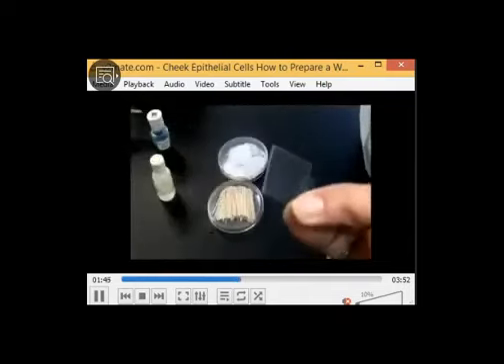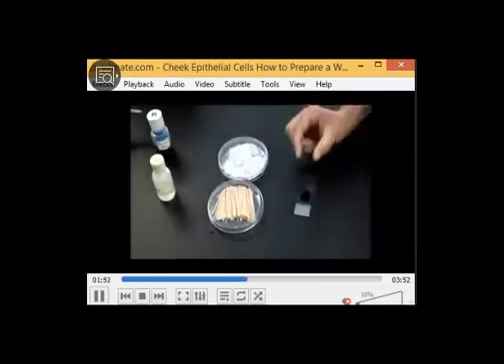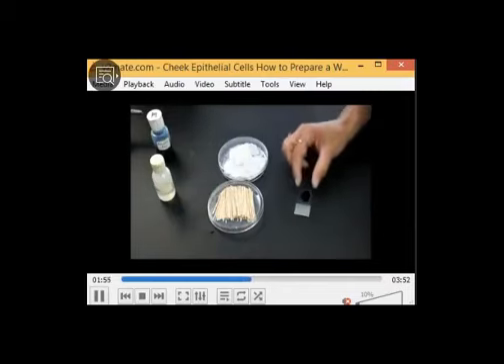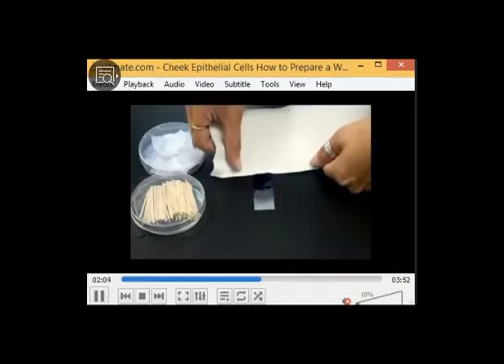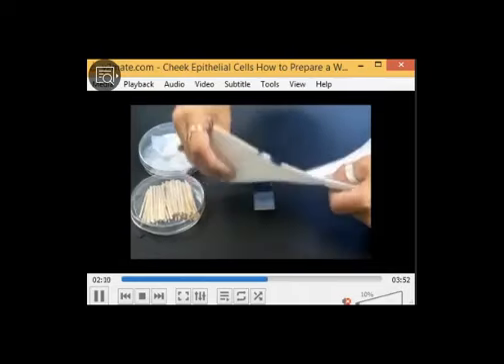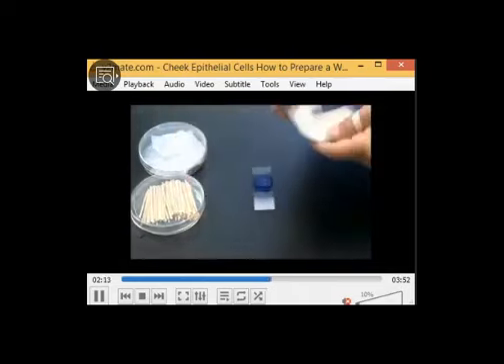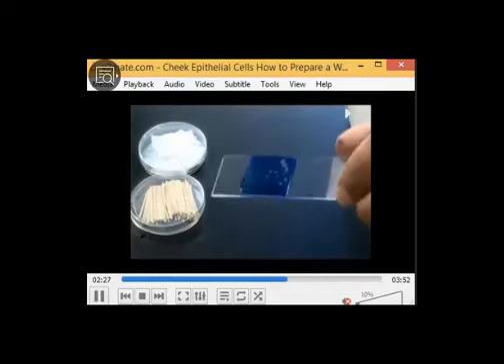Now the question of the cover slip. I told you the method to put the cover slip: 45 درجة, then slowly, slowly lower it like this. Now in the last you will use mandil to absorb jazb the extra sabqa, sabqa zaid, from the corners, from the ends, just to make the slide clean. Now this is the complete slide. This slide we will put in the microscope.